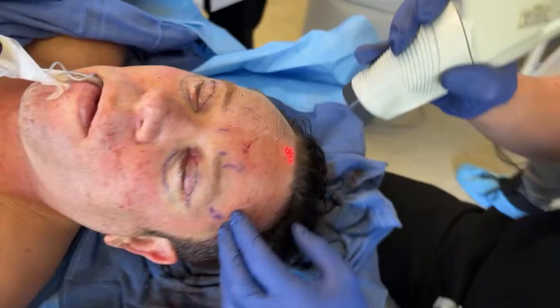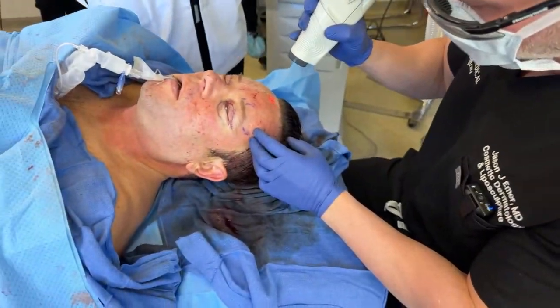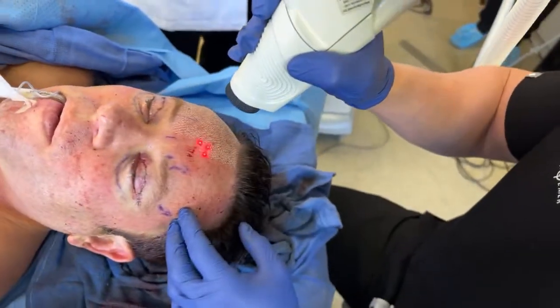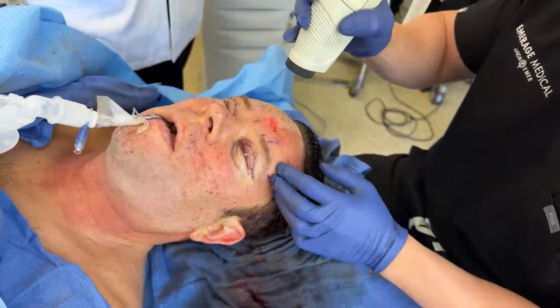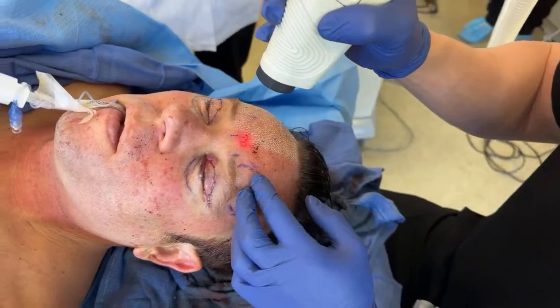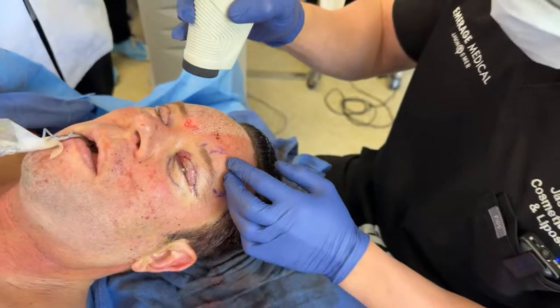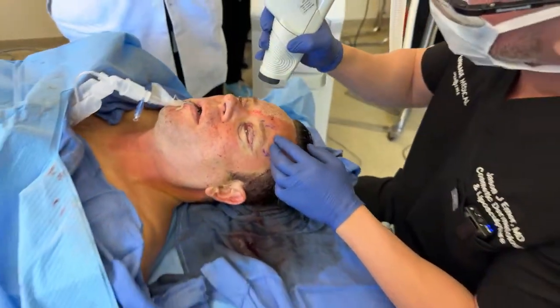So now, yeah, go ahead. Let's say, Dr. Sandin, do you want to grab your before photos and show us what you did? That would be great. Yes. Do we have them? See if we got them so you could see. What was his goal, you guys? His goal was anti-aging and rejuvenation because he's hitting that middle age. So is this ablative or non-ablative? This is ablative, guys. Dr. Sandin's going to show us what we did.